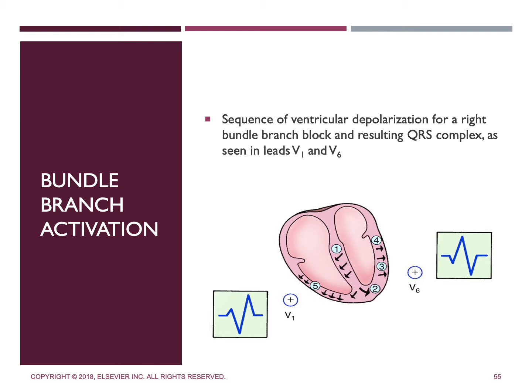So what this depolarization does is it creates a movement of electrical activity in the direction of V1. And so what we'll see is a second positive deflection is going to be recorded, which is R. So the RSR pattern is characteristic of a right bundle branch block. And the RSR pattern is sometimes going to be referred to as an M or rabbit ear pattern.